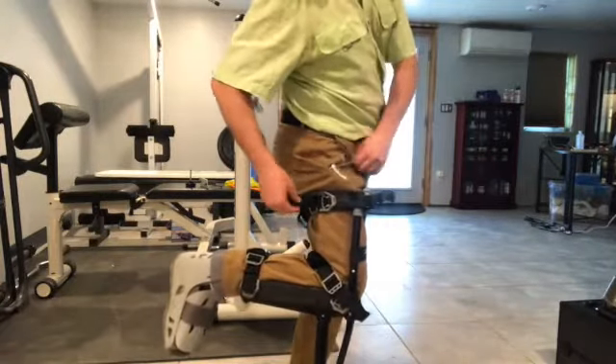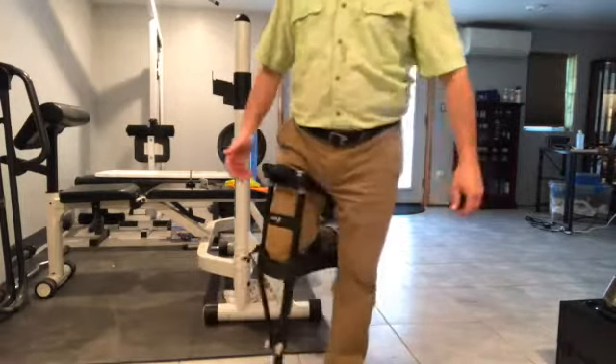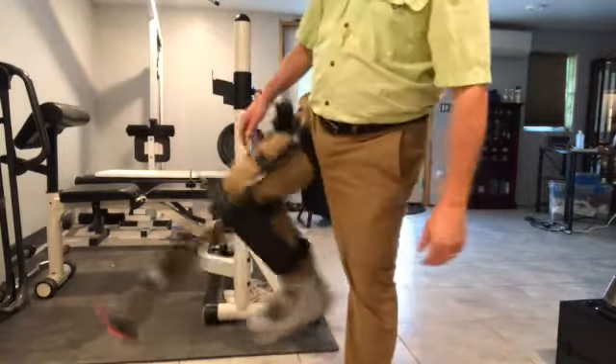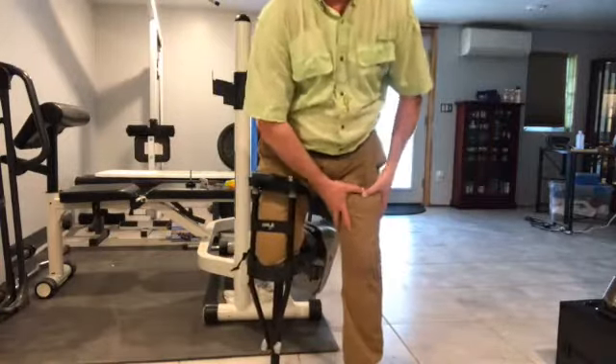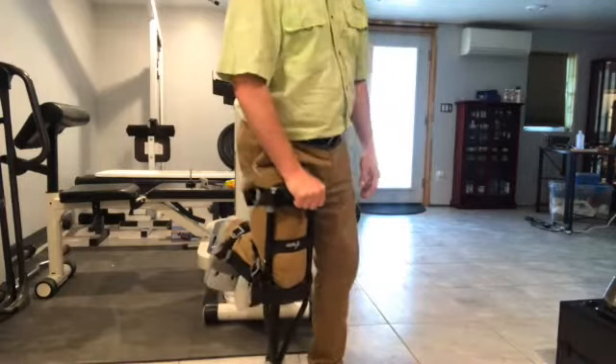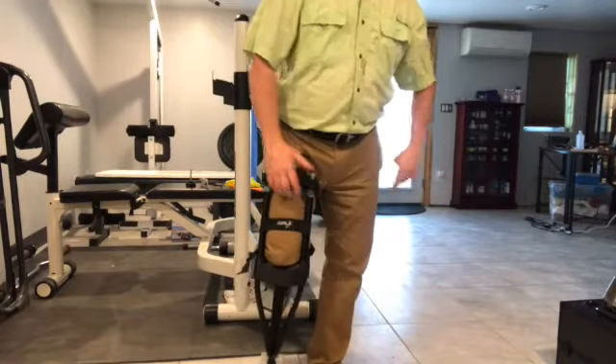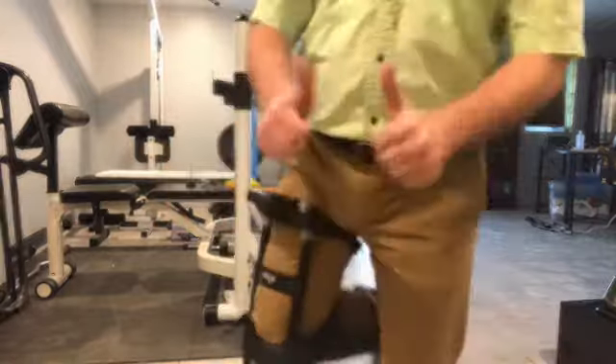It's kind of nice — they have velcro tabs so they can hold the straps out of the way. Once you have it on and you're good to go, it's going to strengthen up your quadricep in about two weeks. You're going to have one strong leg, whichever it might be. Tell me what you think of it — give me the thumbs up.